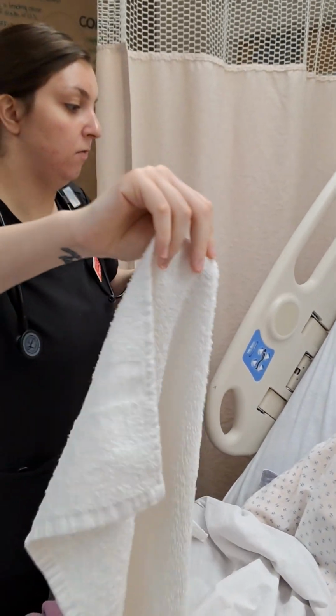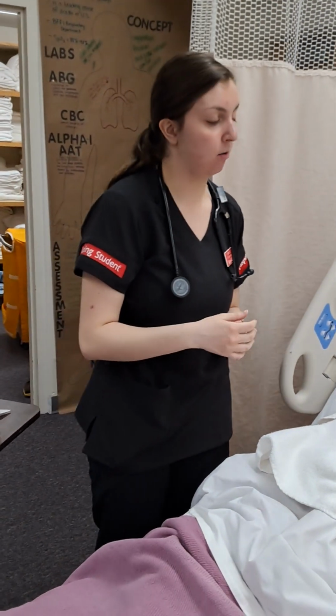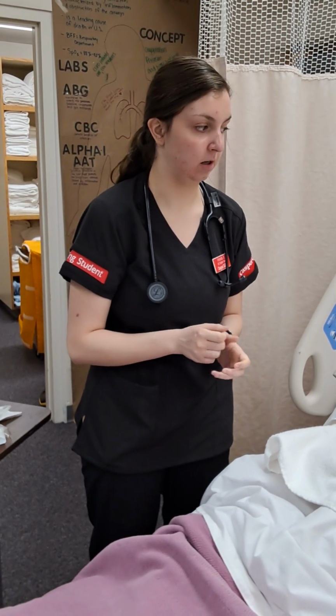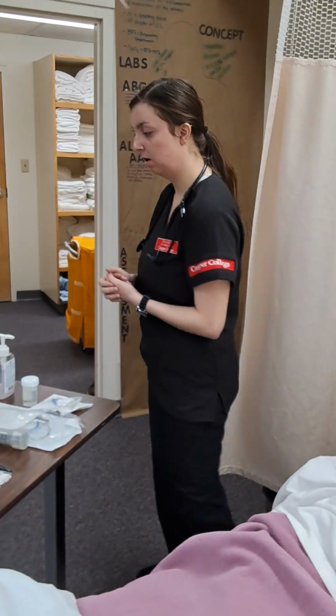At any time, if you feel pain during this procedure, raise your left hand and I will stop. I will also stop if he's excessively gagging, coughing, if he becomes cyanotic, or if he can't talk or hum. I will stop if he does those things. Okay, now I'm going to do my hand hygiene and apply some clean gloves.